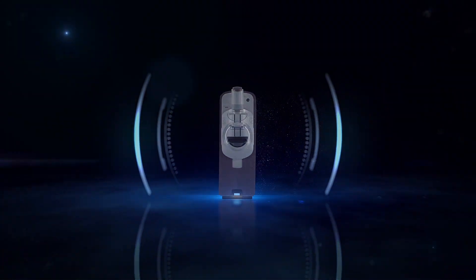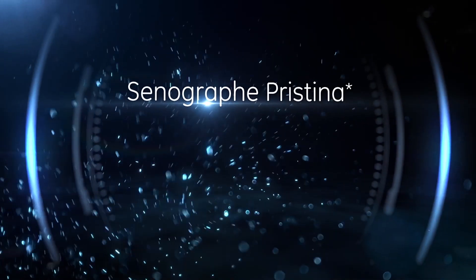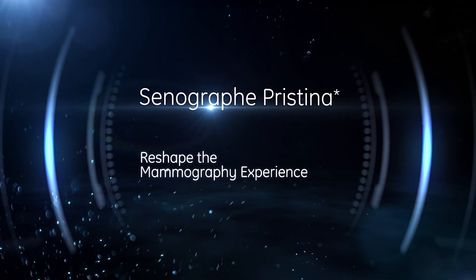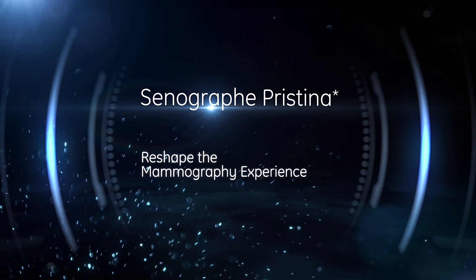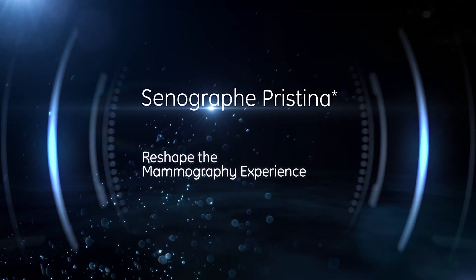Senographe Pristina, destined to reshape the mammography experience forever.